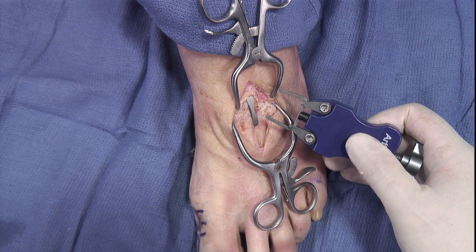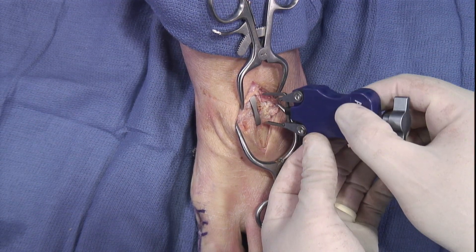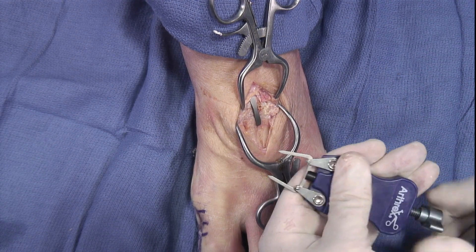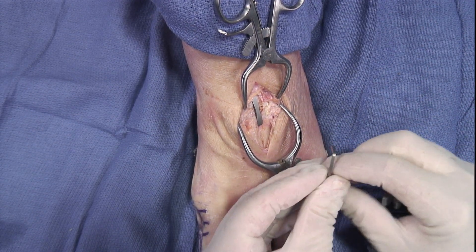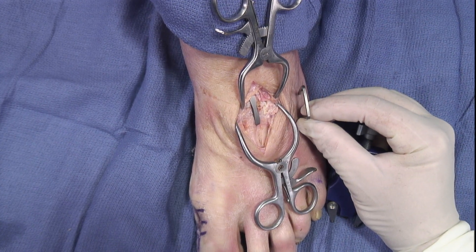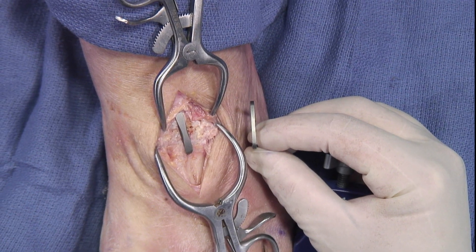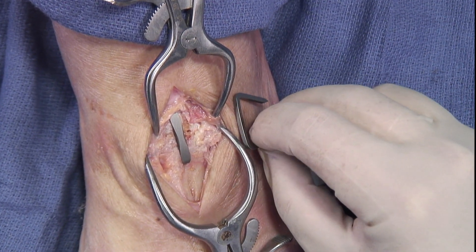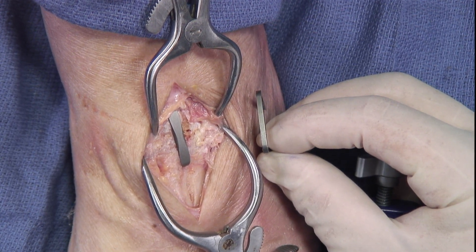The staple we inserted is a little bit wider. We also have a staple that has the same length but is just a little bit thinner in that plane — for a smaller foot or if you're concerned about the width. You could use a smaller, thinner staple that still has the same length. So there are two options here for TMT joints if needed.